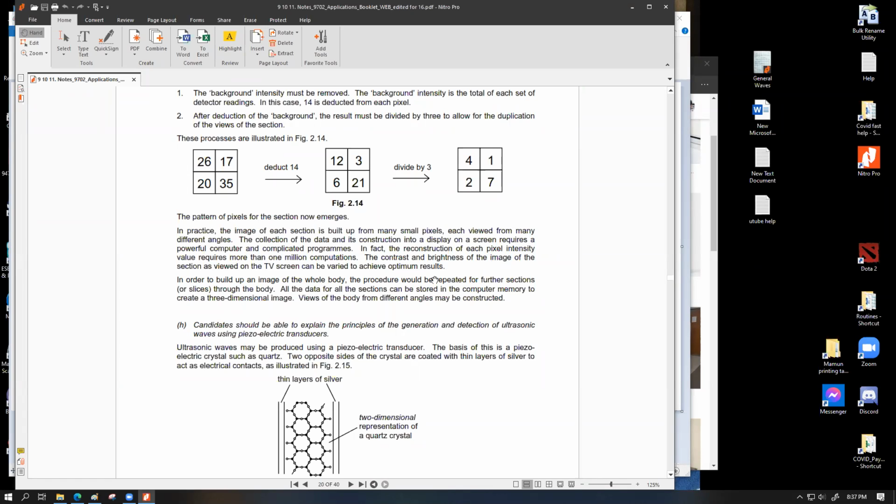It says, was this done to translate the density of the body? Yeah, essentially, exactly. I would not say it's basically the physical density, but it's somewhat of an absorption coefficient, a measure of how much X-ray beam was absorbed within that segment or voxel of the body tissue.